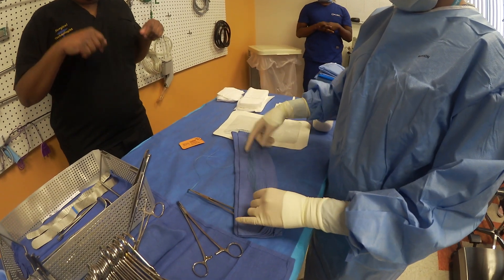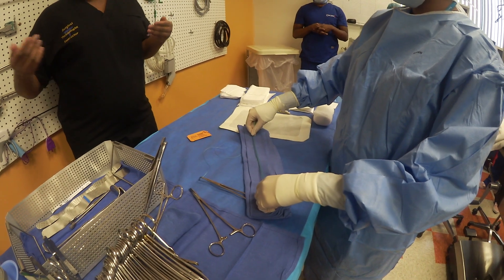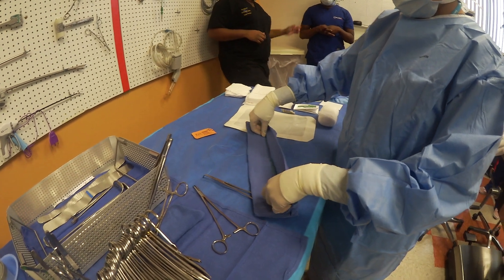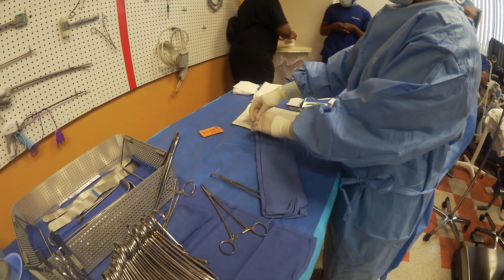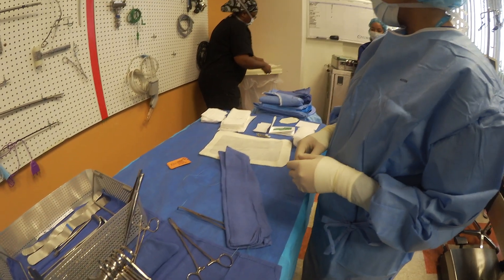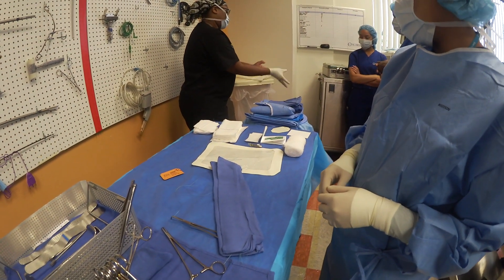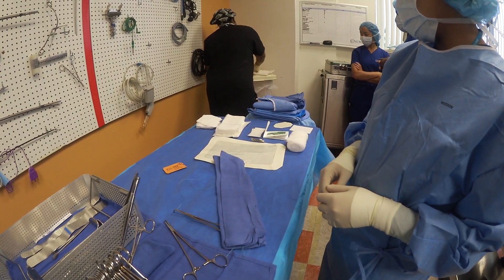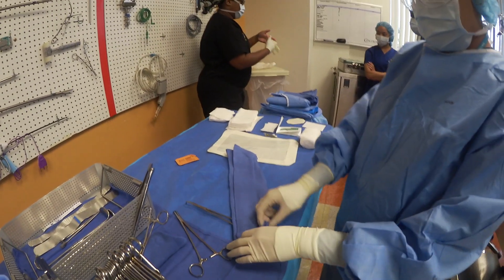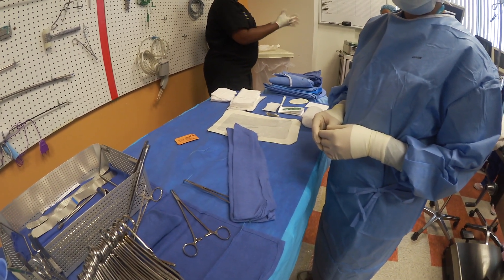Let me walk you through exactly what we mean. You're getting it right, but you just got to stick it through the folds. Get in the habit — this is a practice OR, but get in the habit. If you have different size sutures for your ties, be sure to keep track of the different size free ties within your towel.